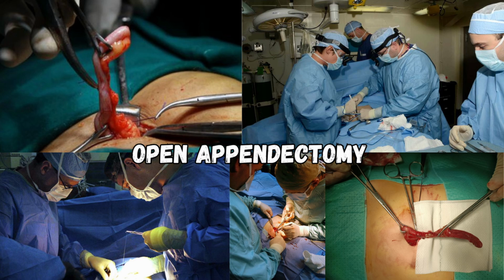Step 4. Entering the peritoneum. The transversalis fascia and peritoneum are gently lifted with hemostats and incised sharply using Metzenbaum scissors under direct vision. This step should be done cautiously to avoid injury to underlying bowel.